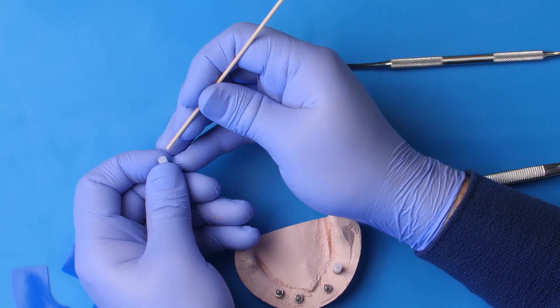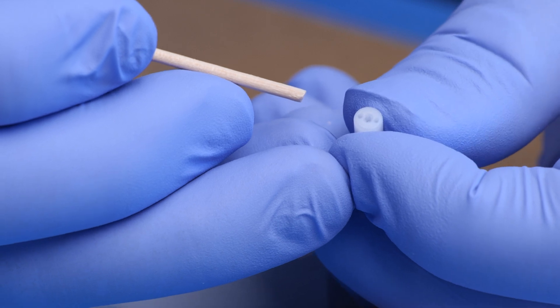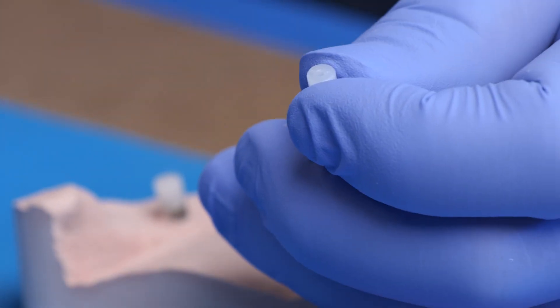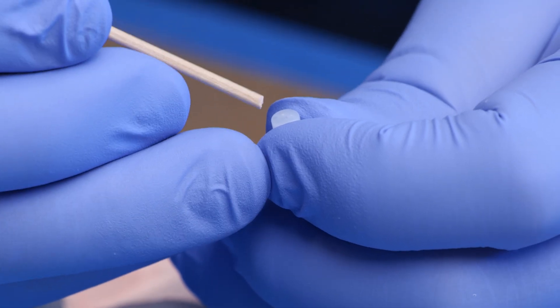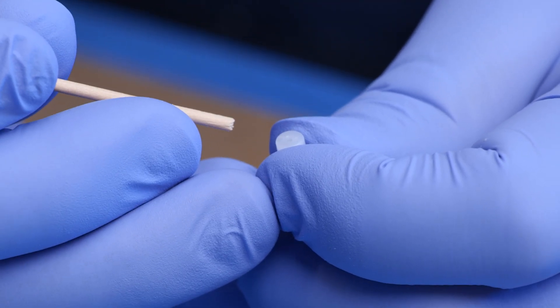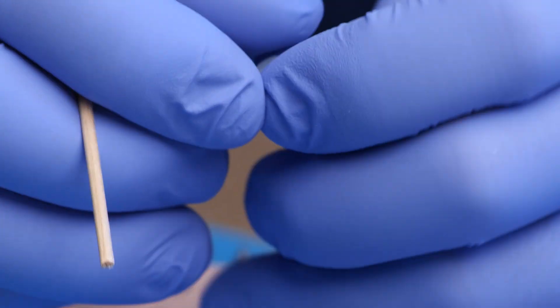There's a drive feature in the center, and then there are two offset holes to that press-on cap. The drive feature allows you to use a torque driver to unscrew it, and the two offset circles allow you to use something like an explorer tip to unscrew it.